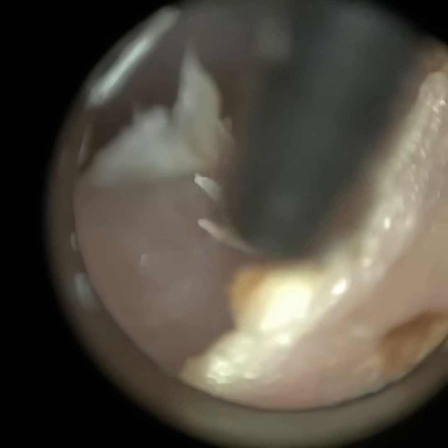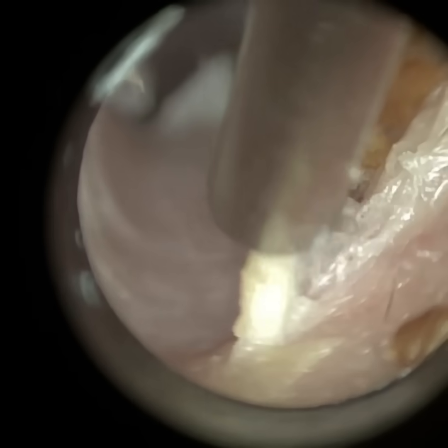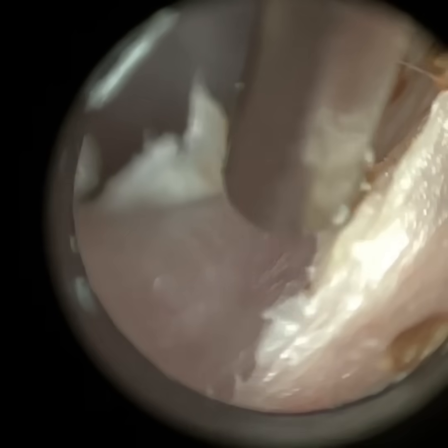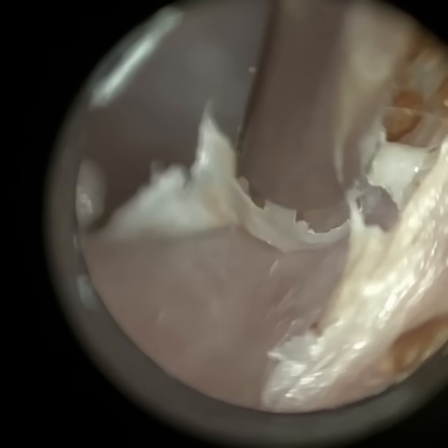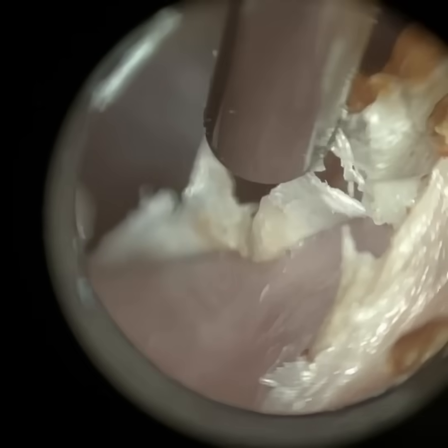There's a bit on the right hand side so I'm going to be as gentle as I can. I'm using the fine end suction probe now, so if there is any contact it's going to be less traumatic and less uncomfortable for the patient in comparison to the 14 gauge suction probe, which we typically call the zolna in the UK.